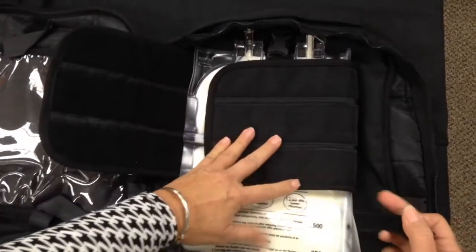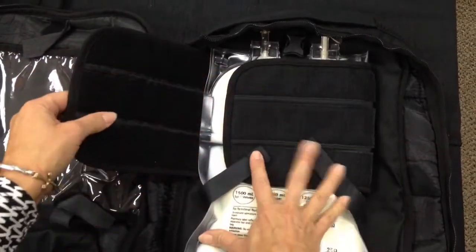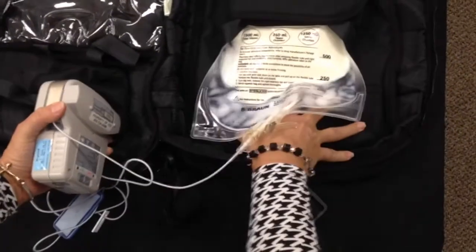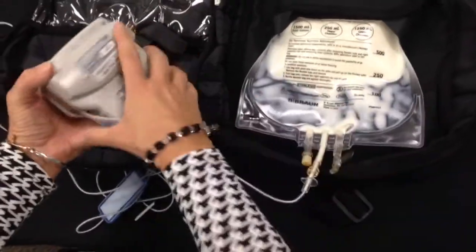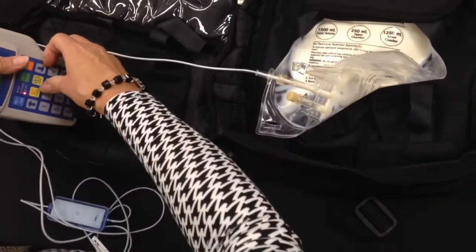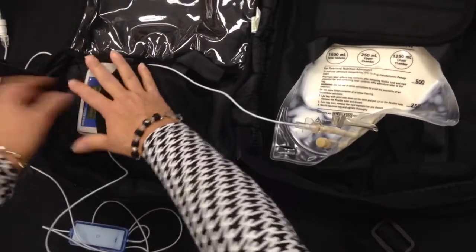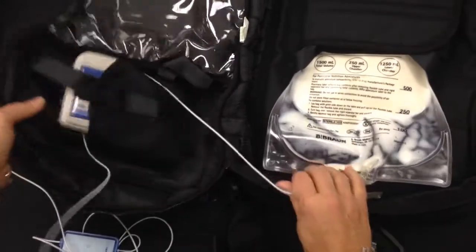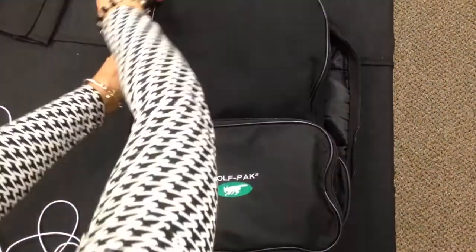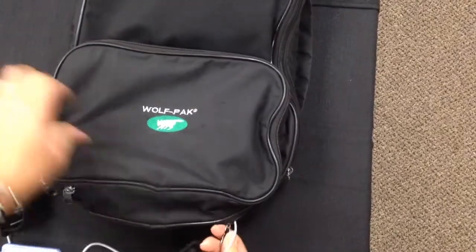Pull your large Velcro back, and there's some extra little Velcros. And then close it up tight. There are 2 pockets down below for the pump, but in order not to crowd the bag, I prefer to put the pump over here. Make sure that your pump is running when you put it in. Fold it over. Zip up your zippers. One at the top, one at the bottom.